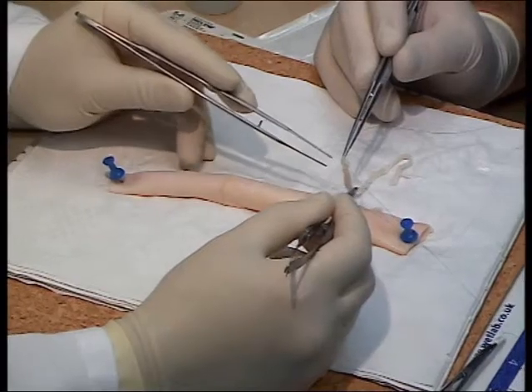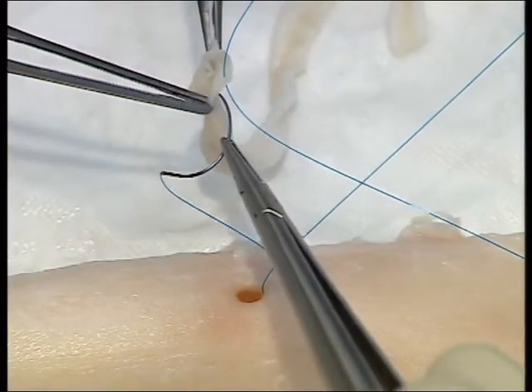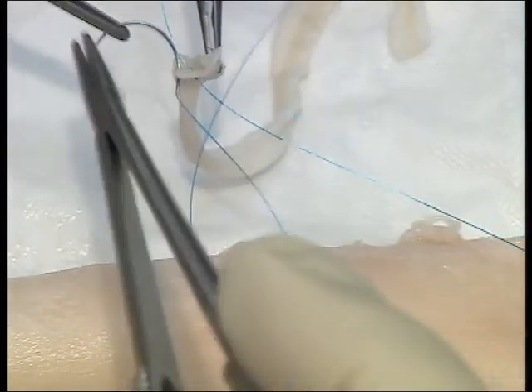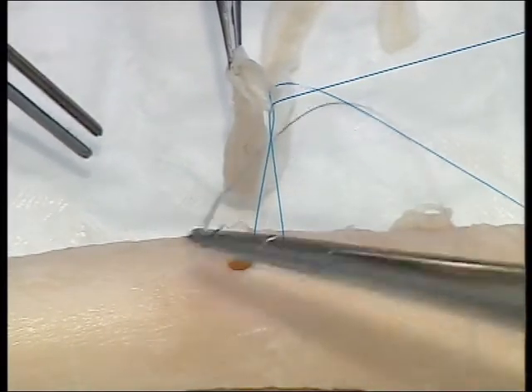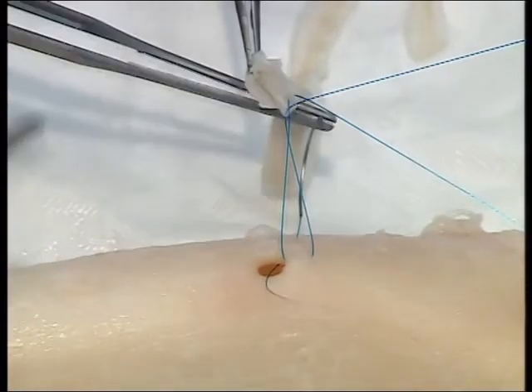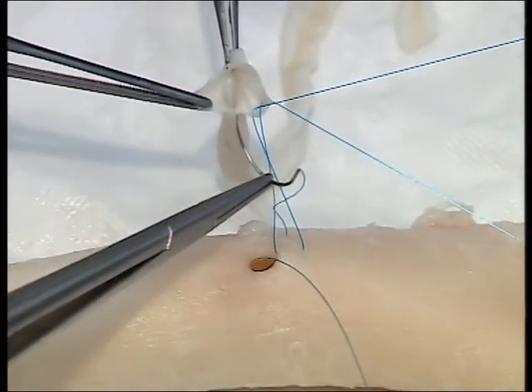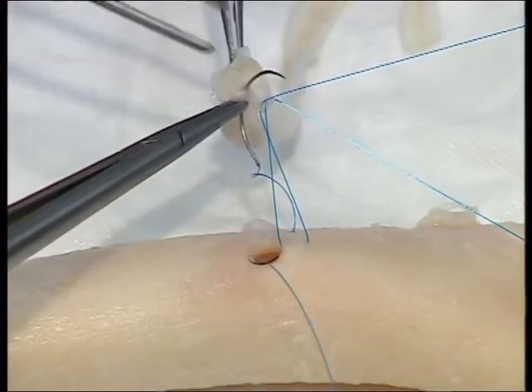You should aim to space your sutures in such a way as to use 5 sutures to complete this semicircle. Pass the second suture in exactly the same way, and then ensure that the next suture goes through the heel of the conduit.